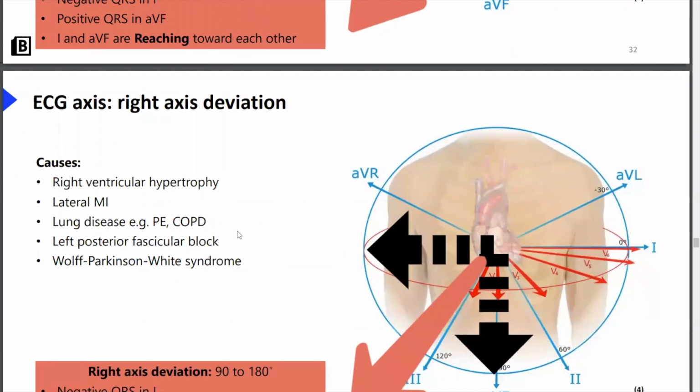Someone's asked, could you also use lead 3 as well? There's a more complex method which uses lead 1, AVF, and lead 3. Just use this simple method. Trust me, it's absolutely fine.